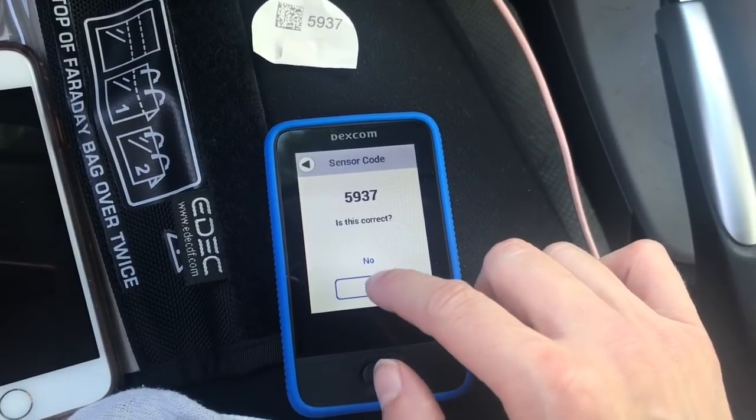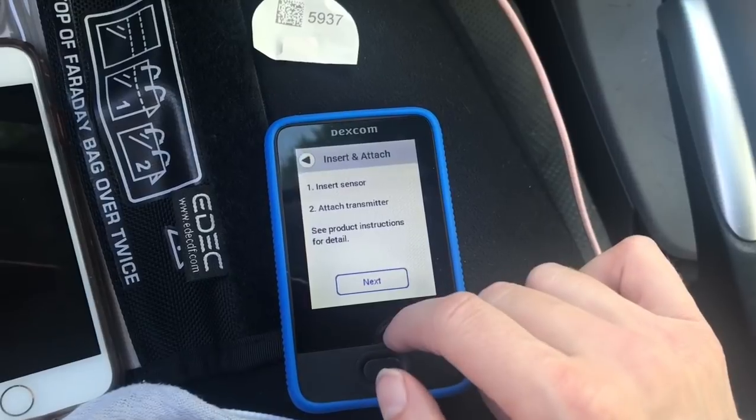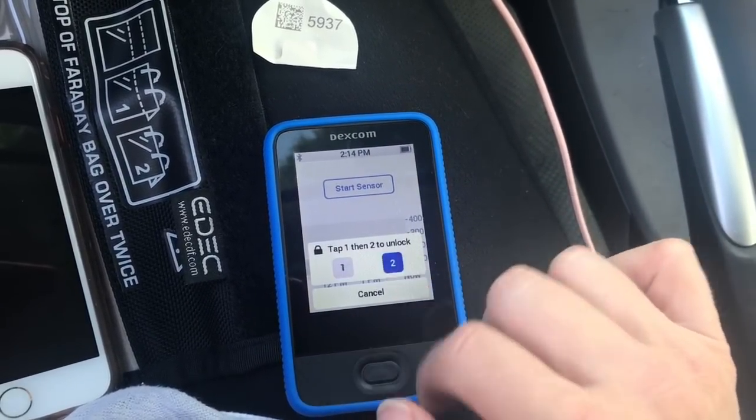We're going to save it. Yes. Checks it. Good. Next. Insert it. Start sensor. Unlock it.